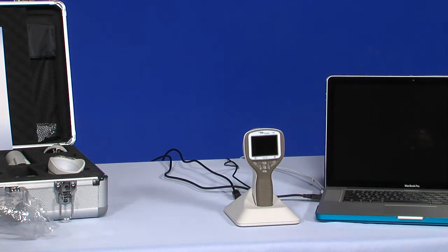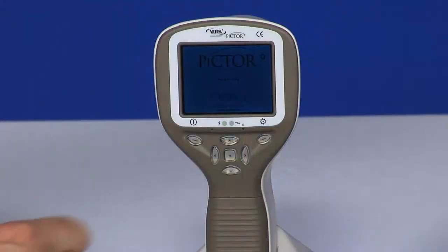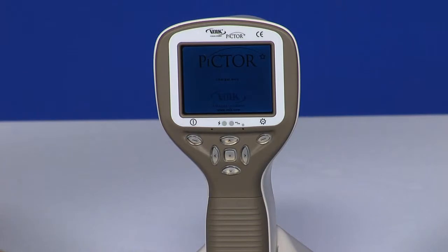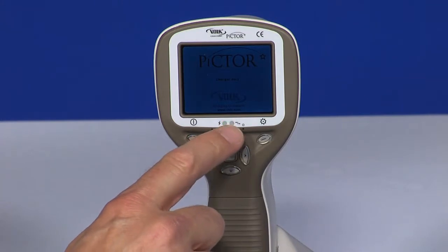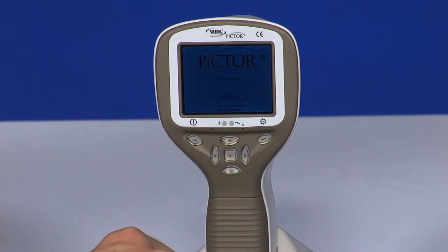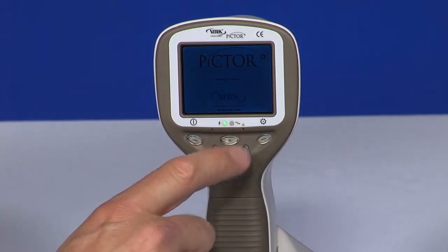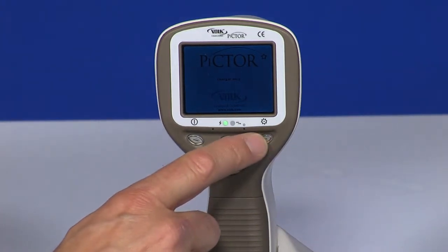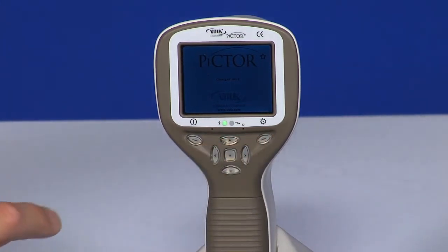Let's go through the buttons and features of the device. The left soft key is used to power the device on and off. Power off by holding the button for a few seconds. There are two LED indicators. The left LED indicates green when the device is on. The right LED indicates blue when it is placed in the cradle and connected to a computer. The right soft key is used to open the menu for device and imaging settings.